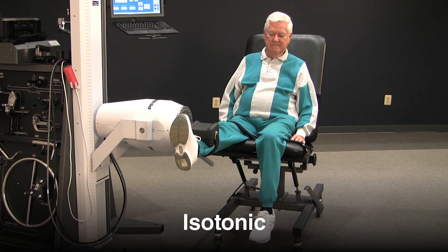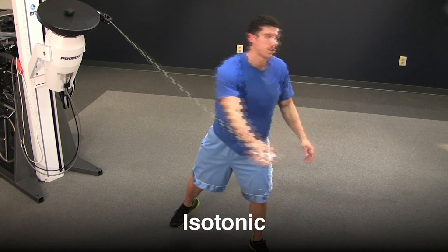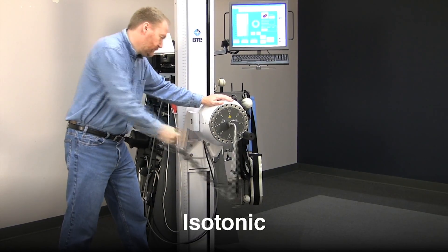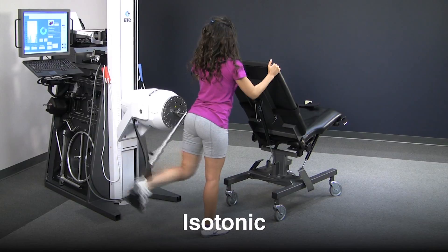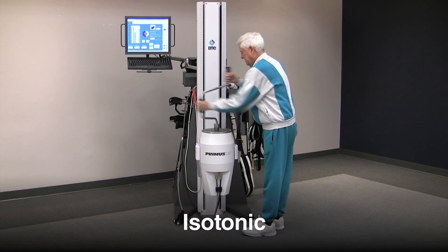The Primus Isotonics works unlike any device on the market. It's smooth, it's agile, and it has no speed constraints. It is the most functional mode to replicate real-life situations. Patients with joint injuries can work the muscle to fatigue without inflaming the joint. Isotonic resistance is indispensable for functional rehabilitation.